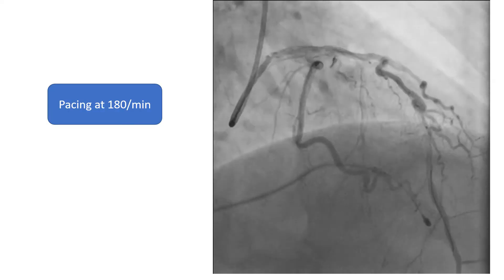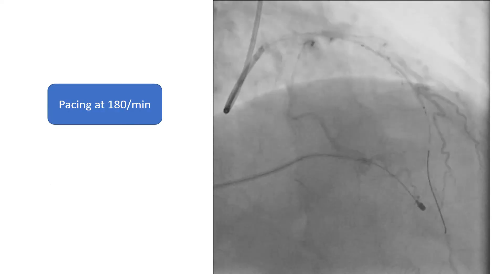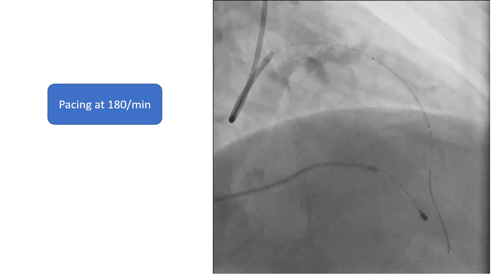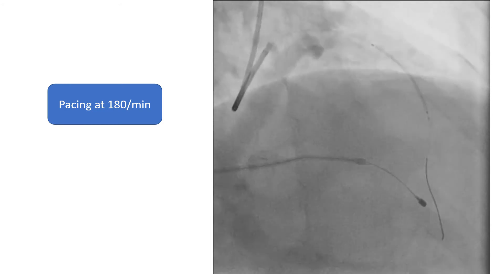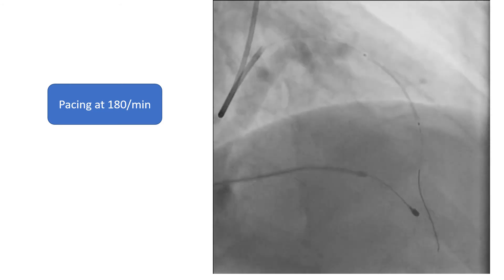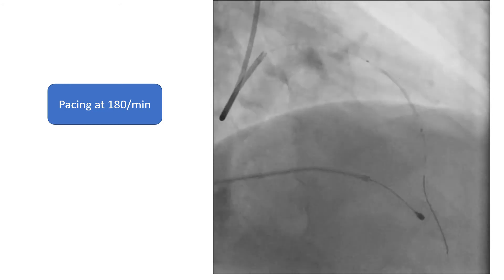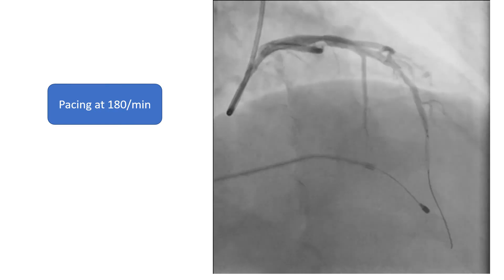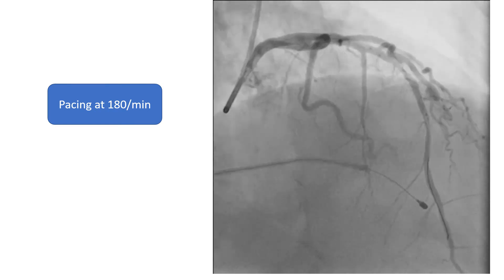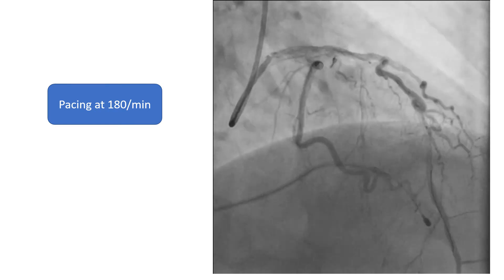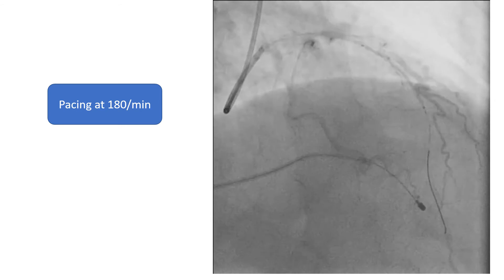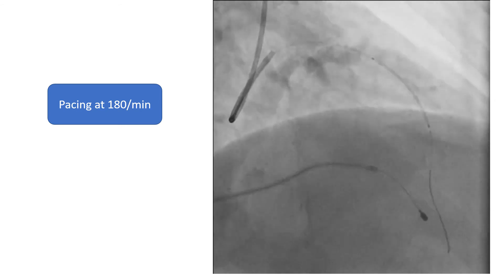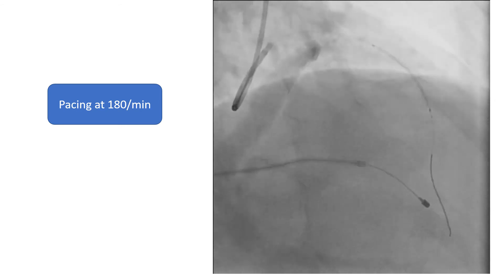So in this case, we inserted a transvenous pacemaker and induced rapid ventricular pacing at a rate of 180 per minute. During pacing, we positioned the stent at the desired location and deployed it.